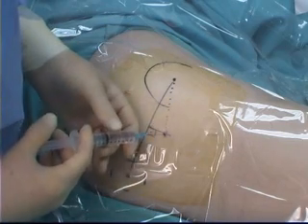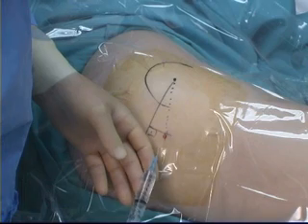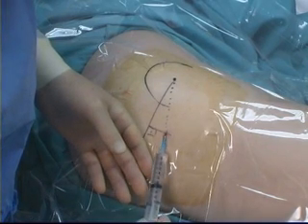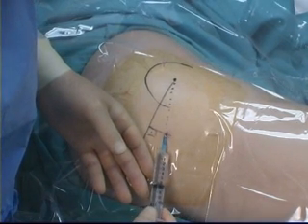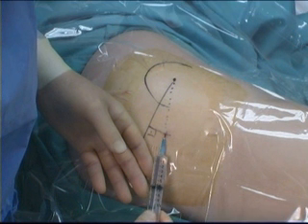After disinfection of the skin and application of a sterile fenestrated transparent plastic drape, the skin, subcutaneous tissue, and intended path of the tunneling of the catheter are anesthetized with a fine needle and lidocaine and epinephrine 1 in 200,000 solution.